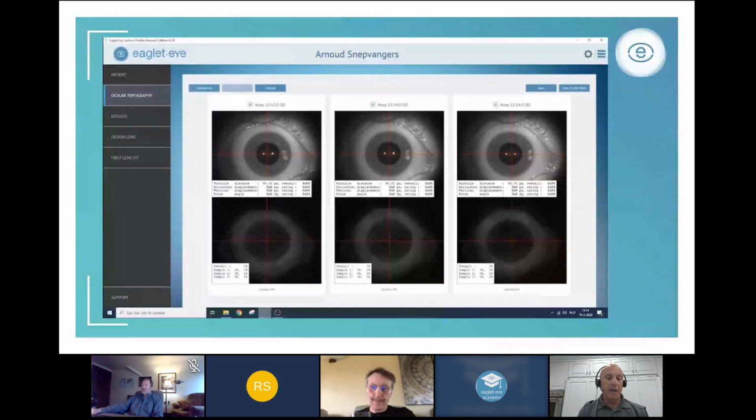Yeah, so we have actually had the best success, as I wrote there, using an operator and then staff to open the lids wide, and we use finger cots to get a good grip. Earlier you talked about the fluorescein strips. We've also been making a viscous solution using the Blink gel with fluorescein infused, and that seems to be getting really good results also, which you'll see coming up.